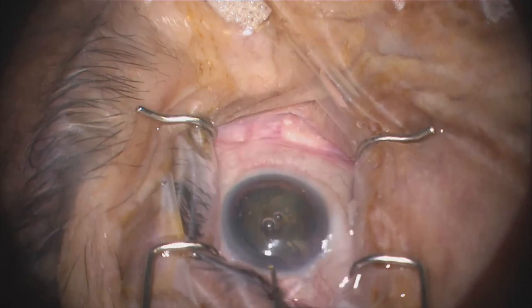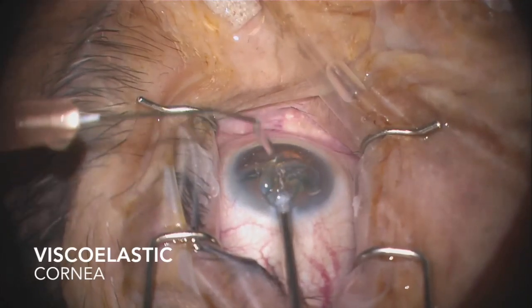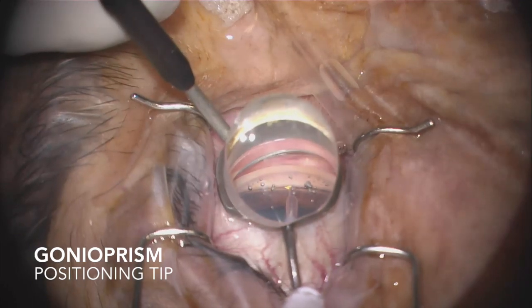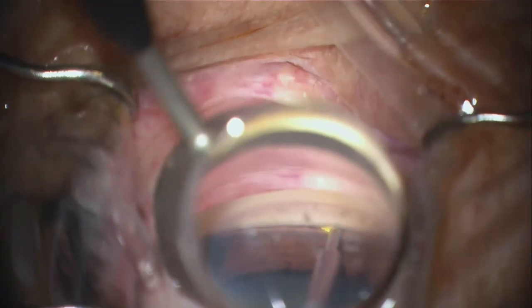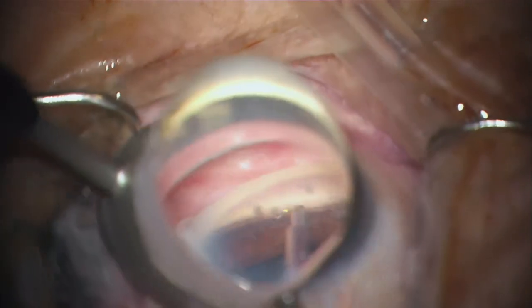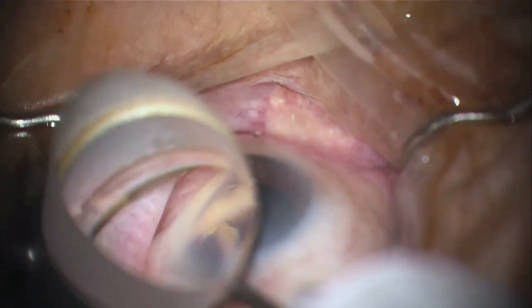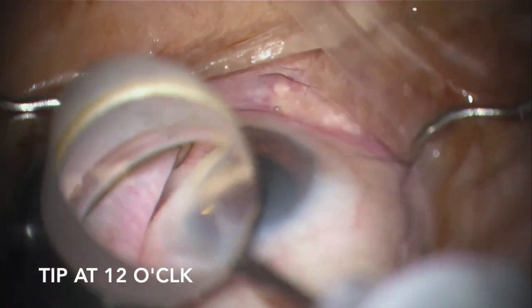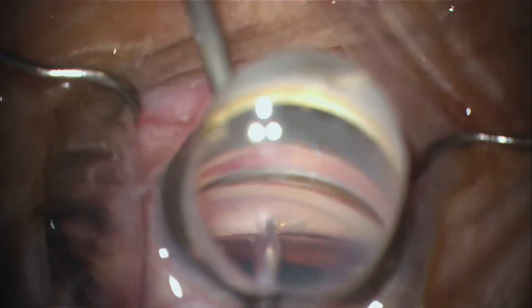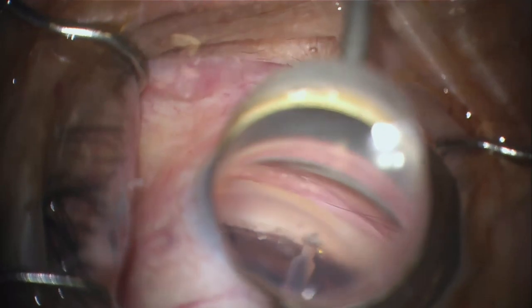Next, introduce the handpiece tip into the anterior chamber through the clear corneal temporal incision and then pass it across the pupil nasally. Then place the gonioprism on the surface of the eye after copious viscoelastic is placed on the cornea to gain an excellent angle view. The next step is to use the sharp tip of the handpiece to pierce through the trabecular meshwork to enter into Schlemm's canal. Then depress the foot pedal down to activate ablation. At the same time, advance the tip within Schlemm's canal following the natural arc in one direction for as long as feasible. Then disengage and ablate in the opposite direction. The arc of ablation should total about three to five clock hours.